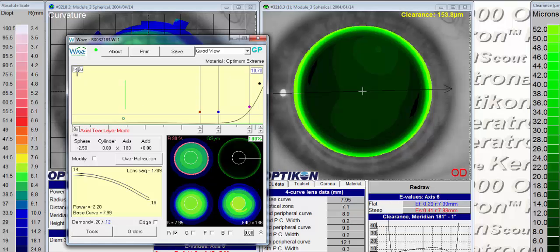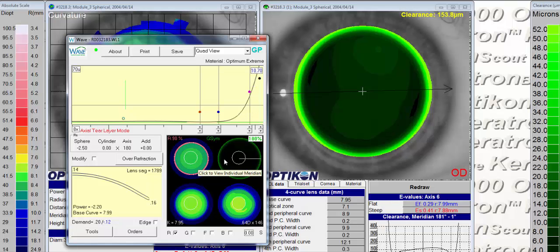And we can see that the rest of our lens is fine. All we've really done is lift the edge quite a bit. And so now we have a very similar look to what we see with some of the other notions out there as far as what makes a comfortable lens. I think this might be part of what some people are noticing with comfort problems on conventional lenses.